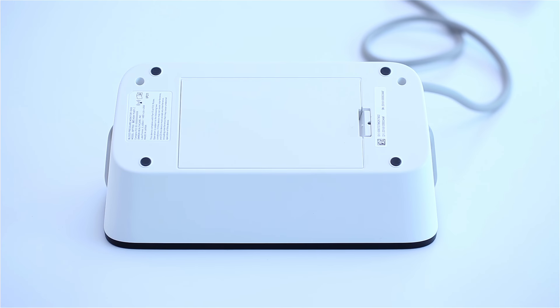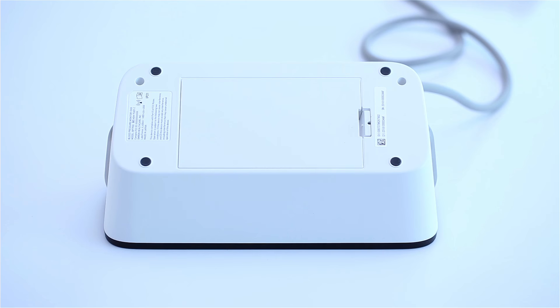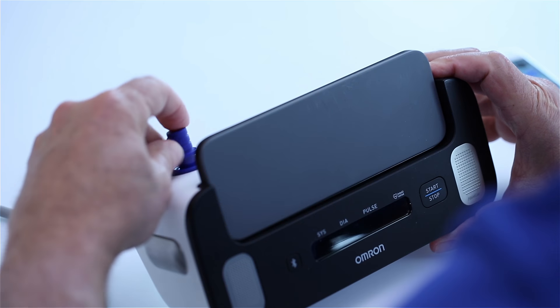Step 1. Turn the device upside down and remove the battery cover. Insert four AA batteries as indicated in the battery compartment and replace the cover. Plug the arm cuff into the monitor.